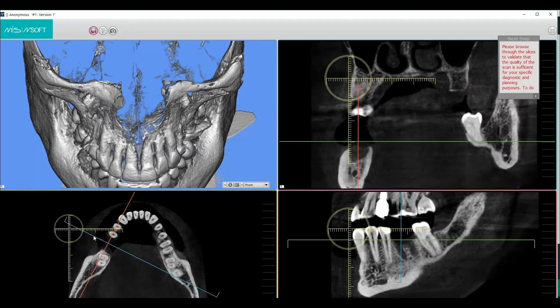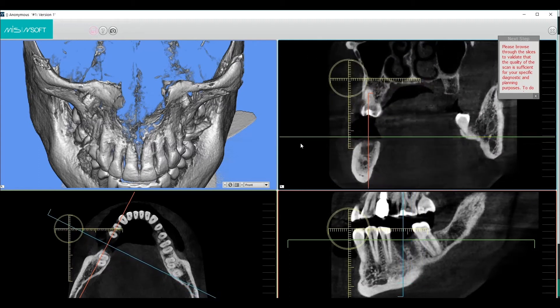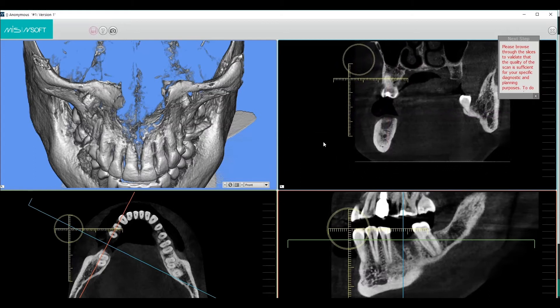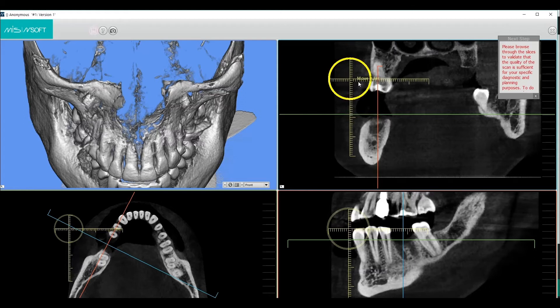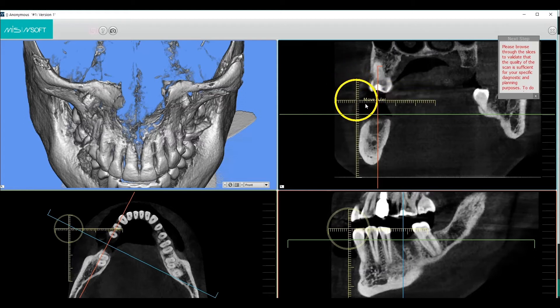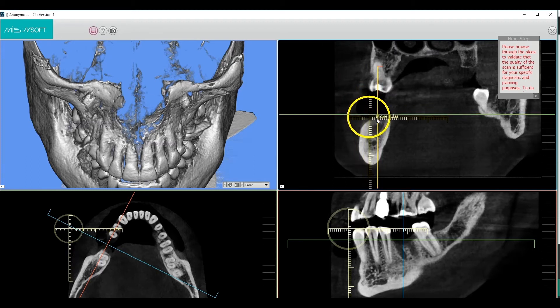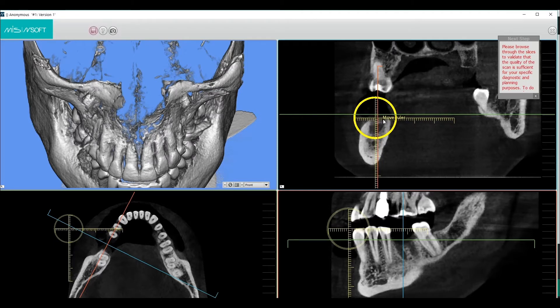In order to move a surfing plane, hover over it to activate it. An activated surfing plane will turn bright yellow when the cursor is touching it. We will move the surfing planes and surf the implantation site to inspect the bone quality and measure the bone.